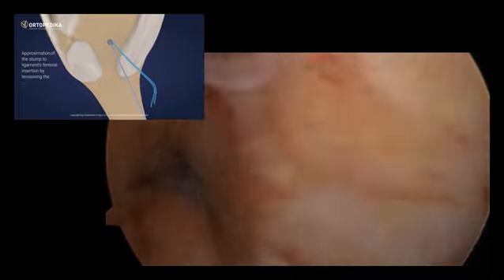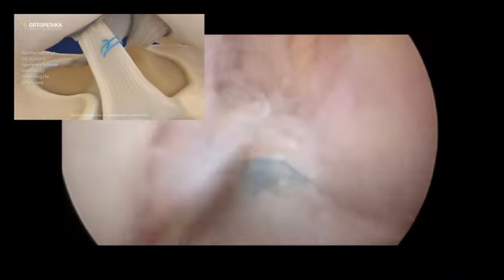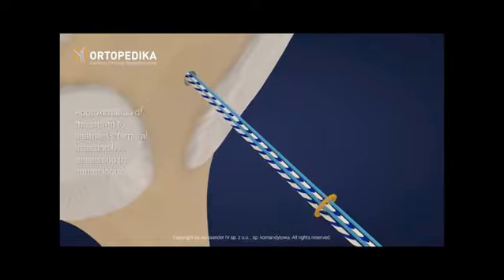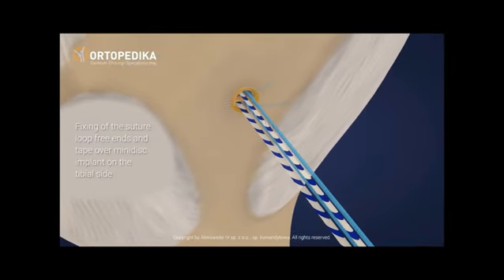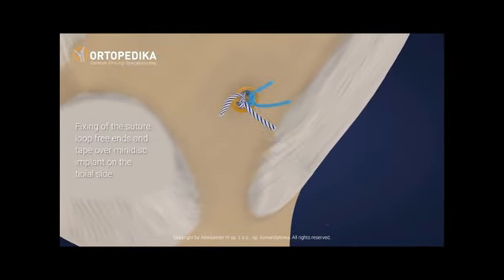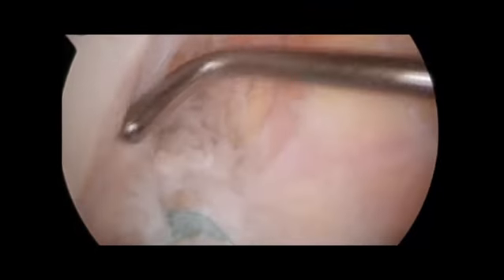The tibial portion of the torn ACL is approximated to the femoral by pulling the tibial ACL tape. After successful approximation, both tapes exiting the tibial canal are tensioned and knotted on the tibial button. The augmented ACL is then inspected for stability, and if it is satisfying, the instrumentation can be pulled out from the joint and the wound closed.